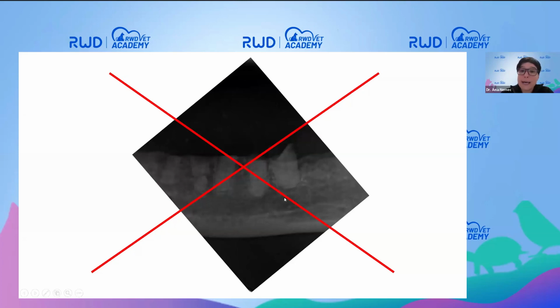So we can see this case. This cat came to us a few weeks after crown amputations when dental radiographs were not performed. So it was a blind crown amputation, which is absolutely not acceptable. And the cat didn't do well after these coronectomies, didn't heal well, the tissues were inflamed, the cat was painful. So we decided to radiograph the dentition, and what we saw is that crown amputation was actually performed on type 1 tooth resorption lesions, and that is not acceptable. These roots will never resorb.